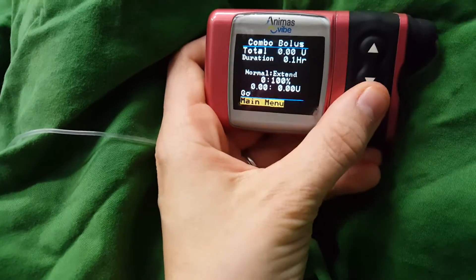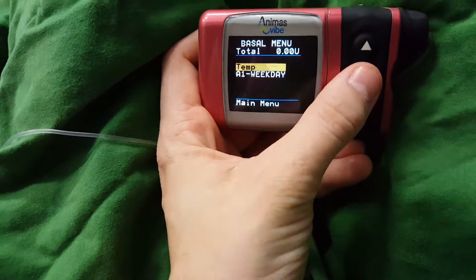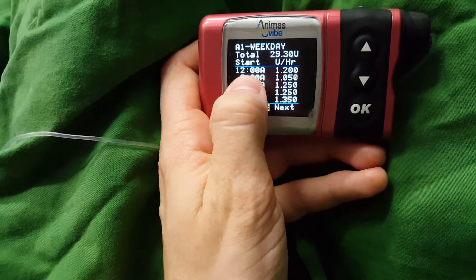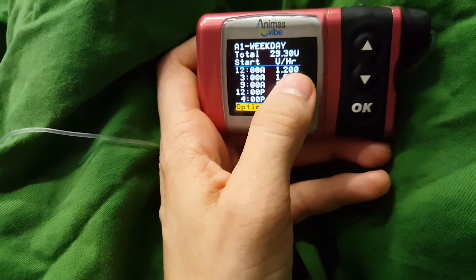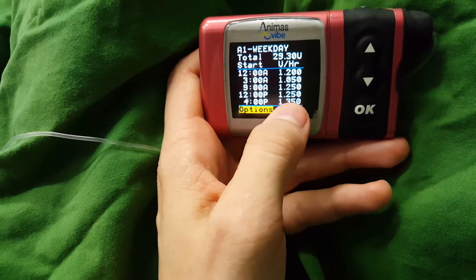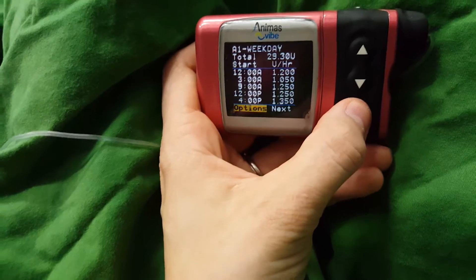Basically with the pump, it'll give you a bit of insulin with your basal rate. This is my basal insulin — so this is per hour between this time period. From midnight to 3am, I'm on 1.2 units of insulin per hour. You'll get a little blip of insulin every three minutes, divided up so that you get each of this spread amongst an hour.